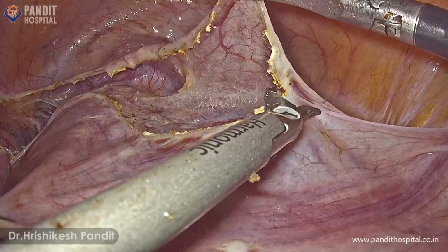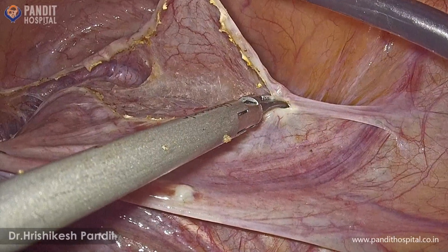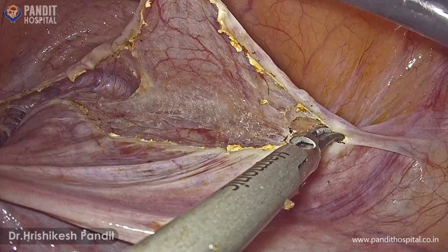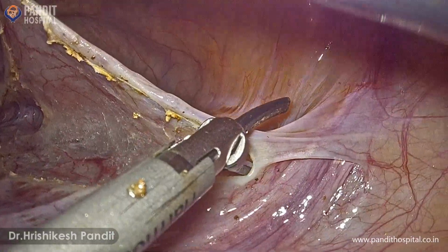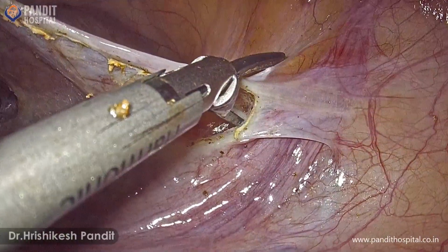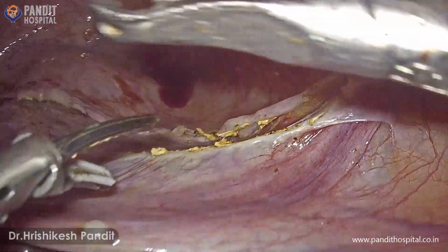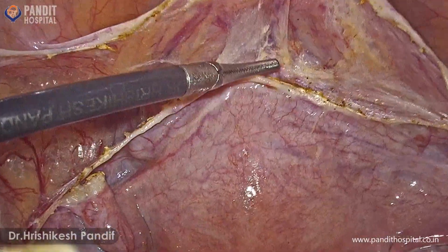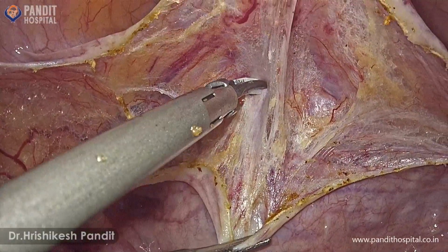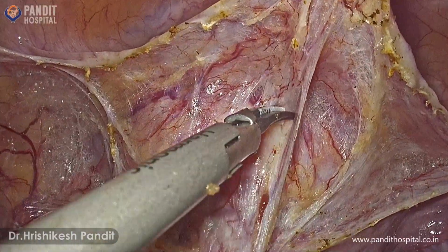We start dissecting between two lateralmost points on the round ligament. The assistant is retracting the UV fold perpendicularly and cranially so as to create bubbles or champagne effect by allowing carbon dioxide to enter into the tissue and create planes. The surgeon also gives a counter traction to create more bubbles. Bubbles are then pushed and strands are cut and bladder is dissected off the cervix.